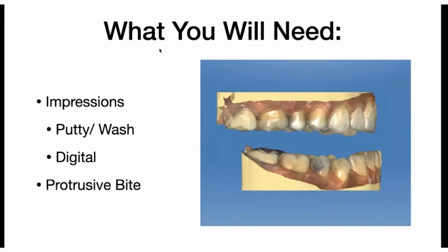It's beautiful, magical. So when we take scans of the teeth, you will need full arch. And the most important part to get is the embrasures, which a lot of scanners aren't good at getting, and the distals of the mandibular second molars.